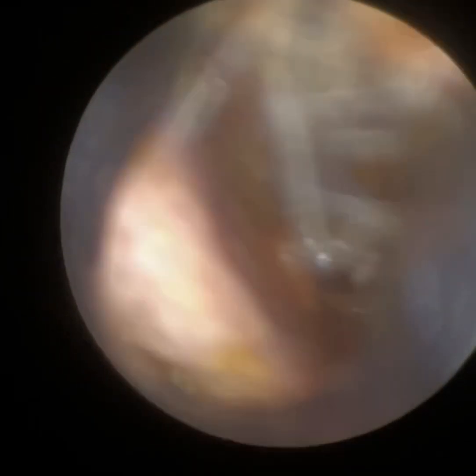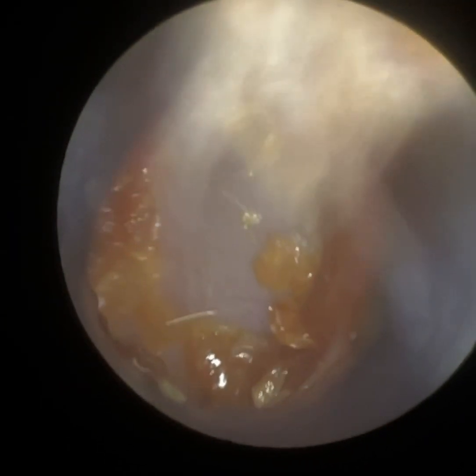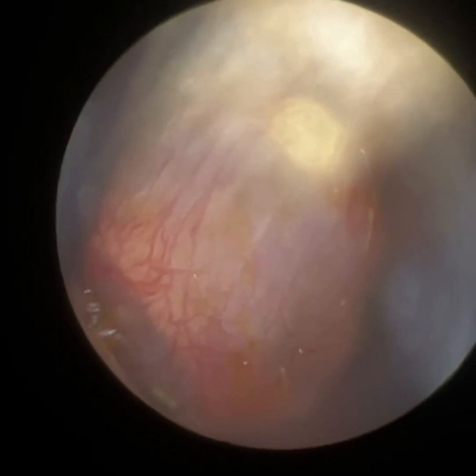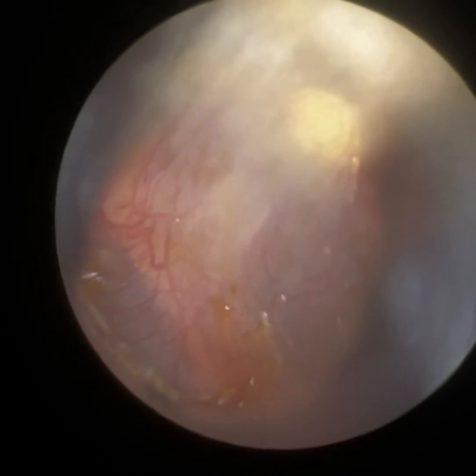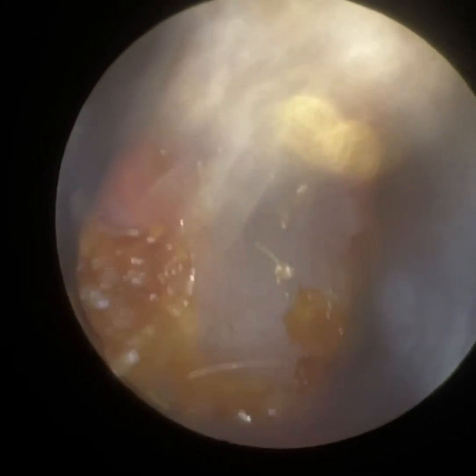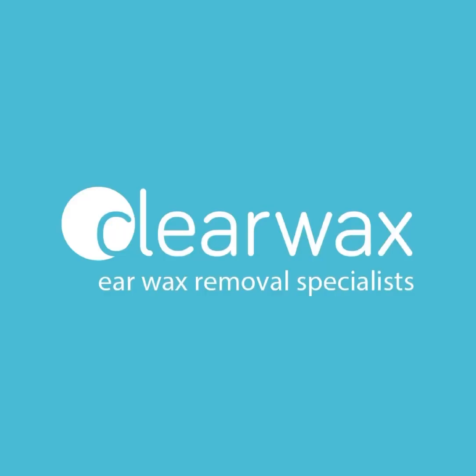So that was a huge plug there. You can see there's the patient's eardrum — there is some residual wax on the drum but we can see the whole eardrum. They have got quite a bendy eardrum so it veers off to the left, but that's the handle of the malleus. We've just left it at that; we don't want to overdo it. I hope you enjoyed that video and as mentioned, if you are interested in the Waxscape please do email info@clearwax.co.uk — thank you.